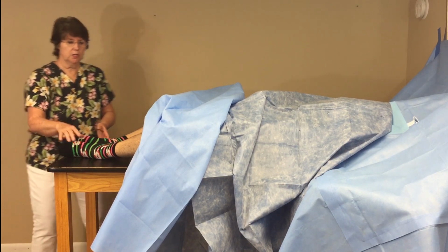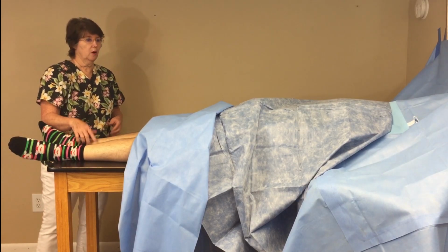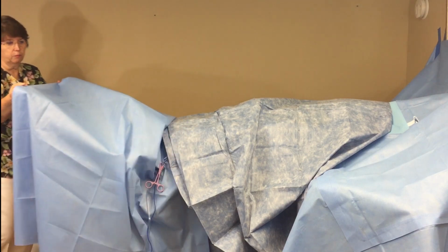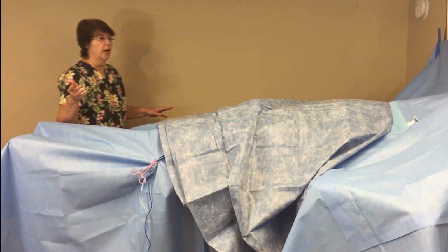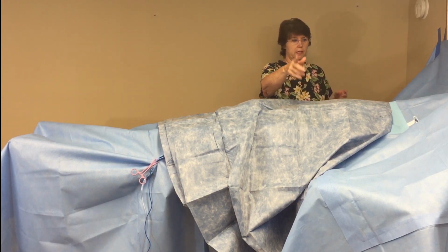They catheterize the patient, then they straighten their legs back down, and they put the seatbelt back on, and then the circulator will come and take this drape that was brought up from the bottom, bring it down. Now we're going to switch roles, and we're back to the sterile people. I'm sterile, and the person on the other side would be sterile.